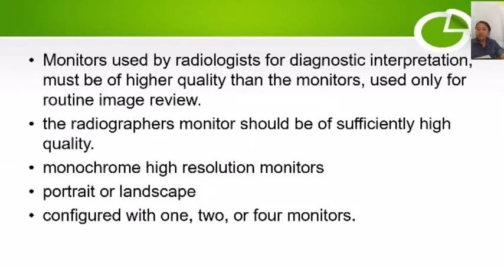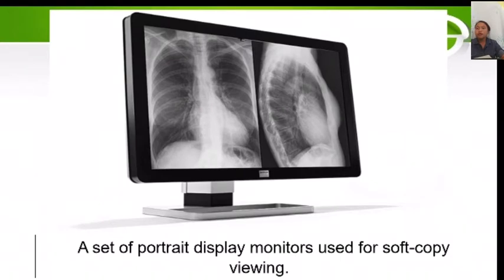Display monitors used for diagnostic interpretations are typically monochrome high-resolution monitors and can be formatted as portrait or landscape and configured with 1, 2, or 4 monitors. So, this is a picture of a set of portrait display monitors used for soft copy viewing.